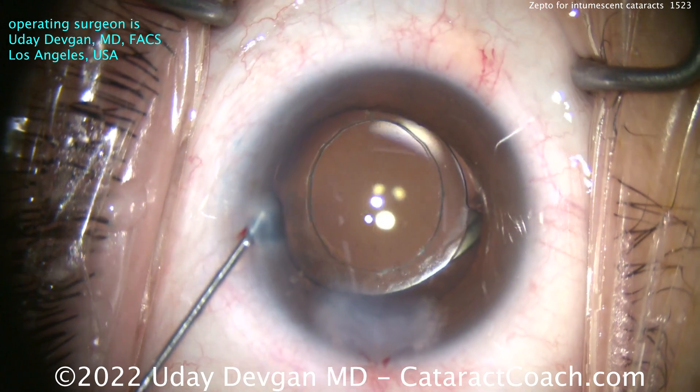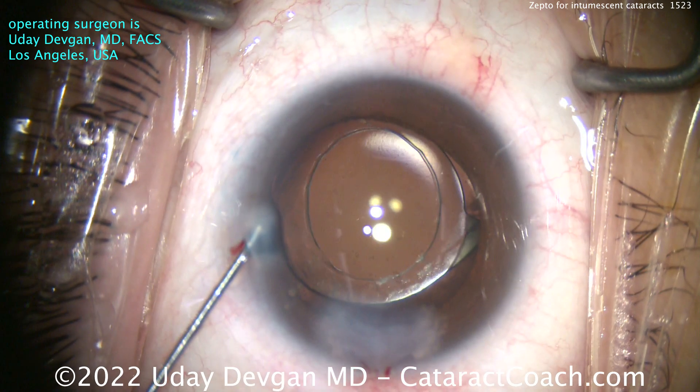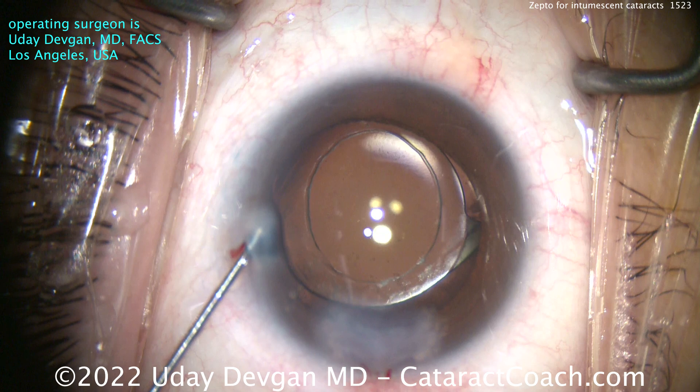Here at the end, let's look very carefully at the Purkinje images — wow, beautifully centered. A very nice outcome for our patients. And that's why Zepto is the gold standard for a case like this.